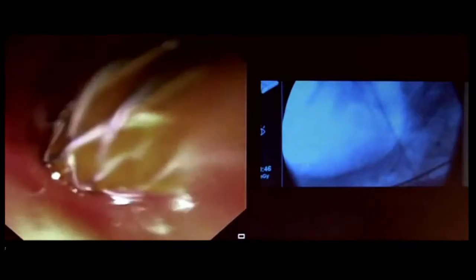So it's out. So obviously I have to pull this all the way out of the patient, and let's see here, I've got a little bit of resistance, so I have to be careful. Okay, it's coming, all right, so we'll have the stent now. Well, then we'll take that off. I'll push this out for you. Do you have it? Almost, okay, let me push it a little further. Okay, good, all right. Close the forceps again, and then we'll pull the forceps out.